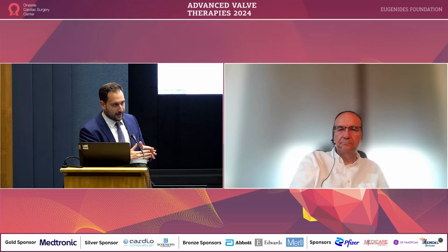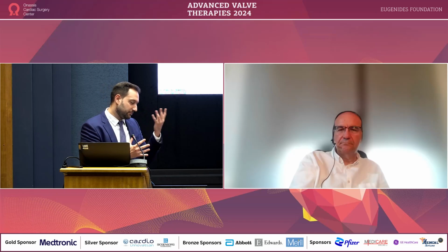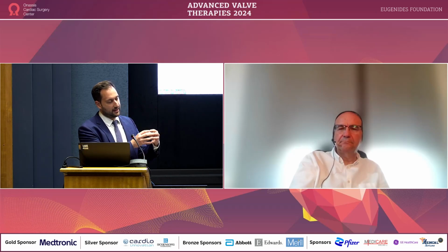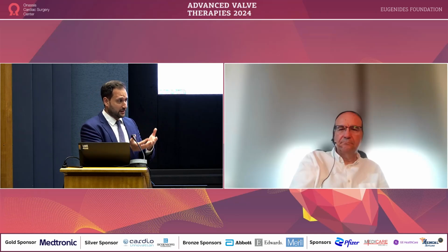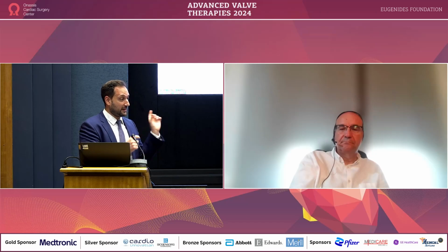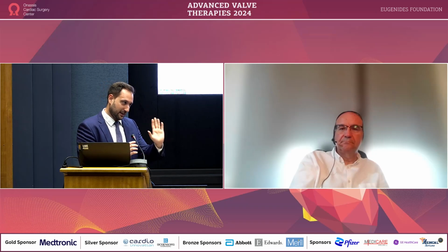That was specific for bicuspid, and in general, where I trained and how we approached the bicuspid valves, if there was a big asymmetric non-coronary sinus and the valve was very calcified, we would always try to implant high in the cusp overlap view. That was sort of the approach. Obviously, we don't follow it religiously right now, but that's what we've done in several cases with this type of bicuspid valves, not for tricuspid valves.